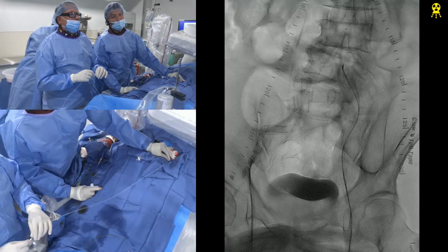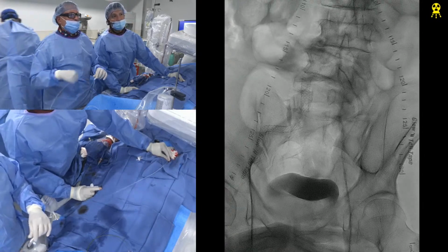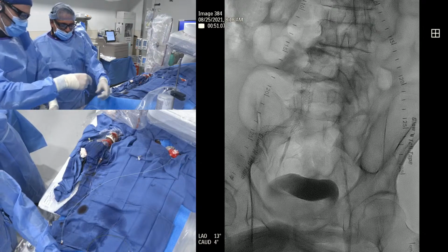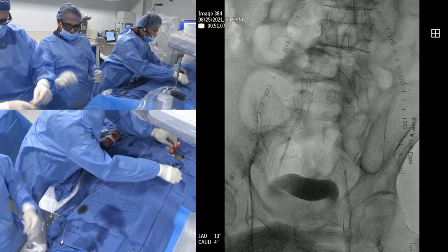Wow. You want to try an 014? Oh, I can, but that's why we did this case live. It's a really tough case. Yeah. All right, you want 014, like a straight Spartacore? Let's try with this one first. It's just soft. Yeah. Or you want a stiff one? If it's stiff, it might be better to plug in, but okay, no problem. Wrong end.